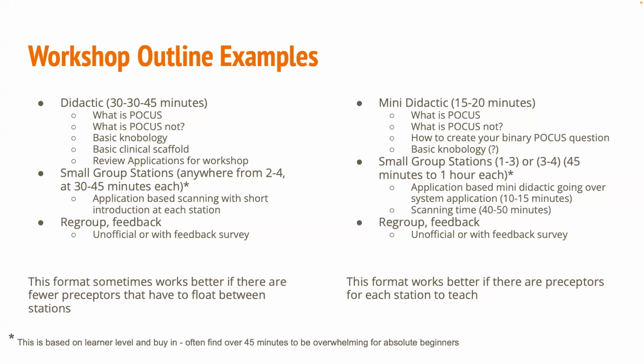And then with the first one on the left, having small group stations, you want 2 to 4 applications. And then you want them to be about 30 to 45 minutes each. You can have them be 15 to 20 minutes. It just depends on what all you were trying to teach them. So you can have a short introduction with your preceptor.